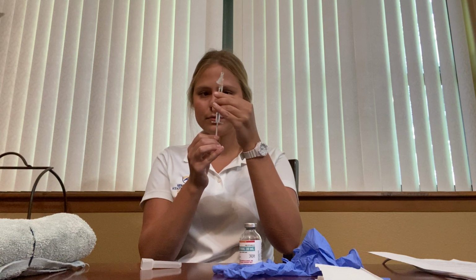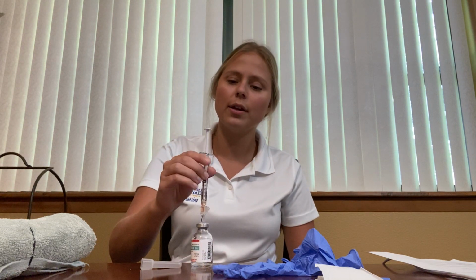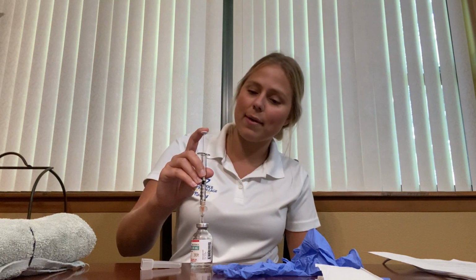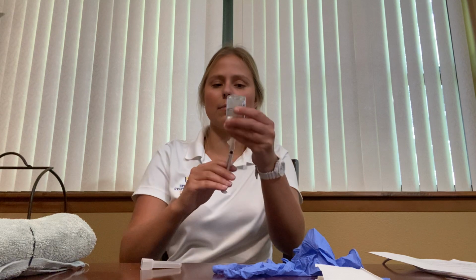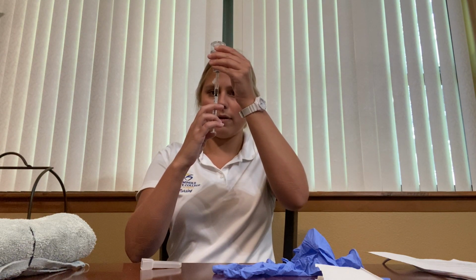Okay, I'm going to draw back the 0.5 mLs of air. Okay, then holding it like a dart, I'm going to insert my needle into the rubber stopper in the vial, inject my 0.5 mLs of air. Okay, and then I'm going to invert my vial and I'm going to draw back my 0.5 mLs.